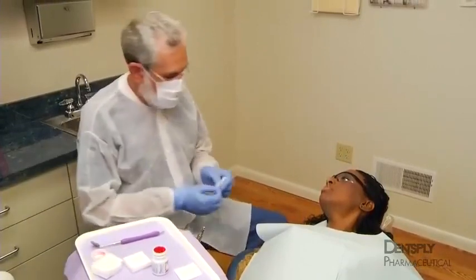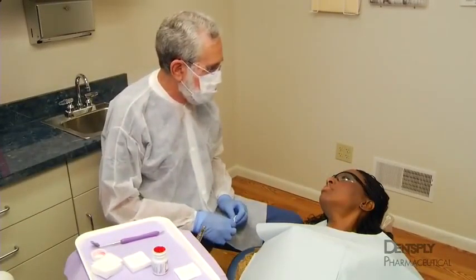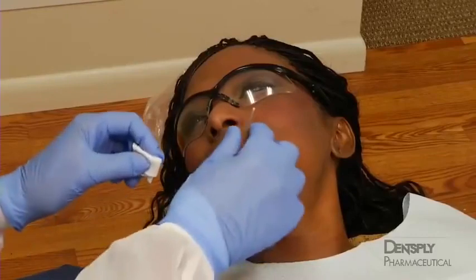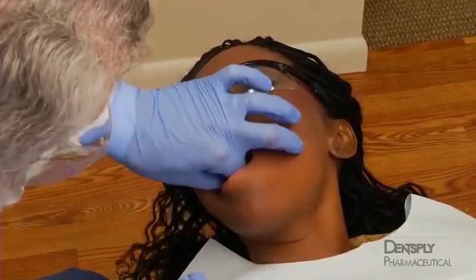with a cotton-tipped applicator. After the topical agent has had time to take effect, it will result in mucosal anesthesia to a depth of 2 to 3 millimeters. Residual anesthetic and surface debris are removed with a sterile gauze immediately before injection.